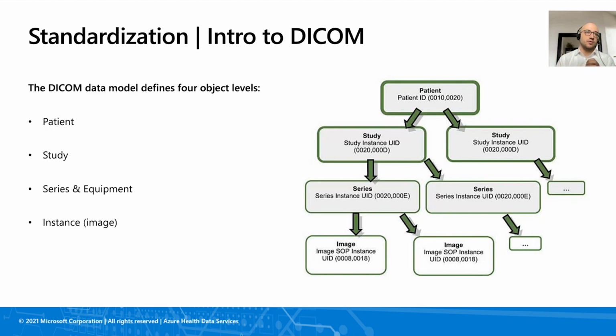For example, while my cardiac CT scan is being taken, they can be taking some survey scans, and after that they will repeat a cardiac CT scan. Each will come as its own series, and a study can have multiple series. And also in one series, for example, in cardiac CT scan, you will have multiple images that make that series.